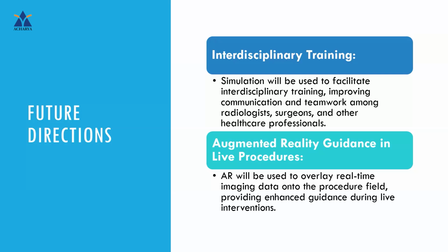And you can also use augmented reality guidance during live procedures. So augmented reality is where you can overlay your 3D data onto your real-time imaging data, and then you can have enhanced guidance during interventions.